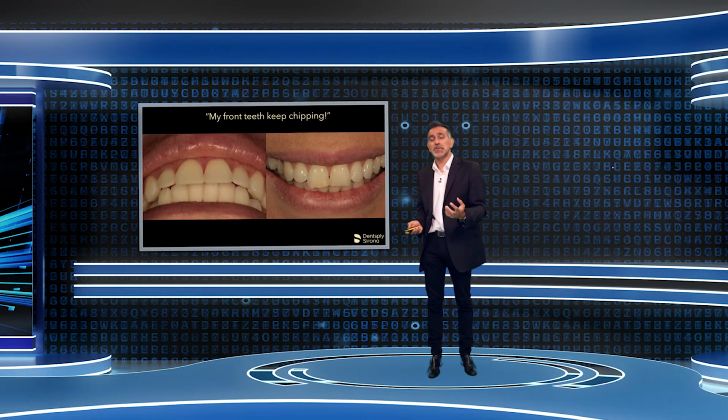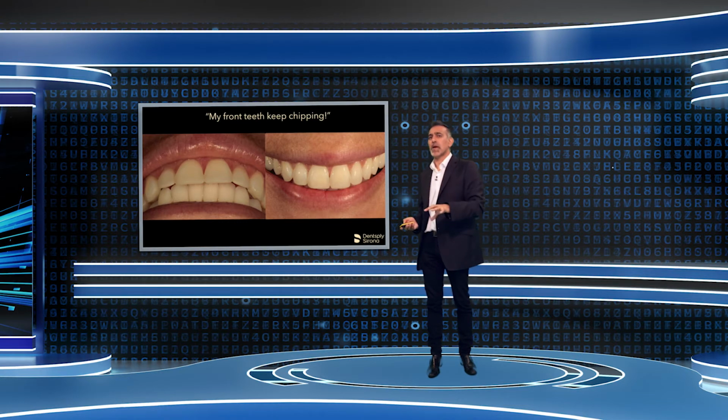So by using orthodontics here and aligners, we actually can align the teeth, upright them, and place our edge bonding to get a much better, more predictable result. Placing some veneers on something like this is not solving the underlying problem. If you place veneers on crooked teeth, they're going to keep moving. And therefore, over time, they either might carry on chipping or cause the opposing teeth to move anyway. And here's the final outcome for this particular patient.